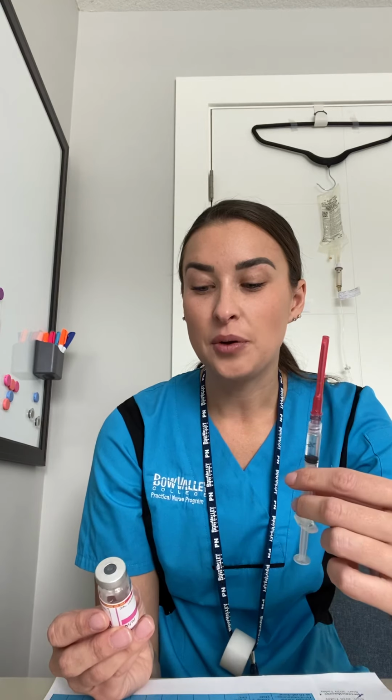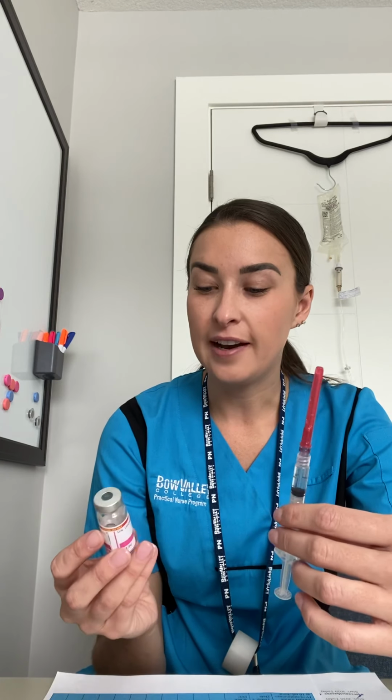We're giving it through IV piggyback. It's okay to do IV or IM. We're going to do it at 1500 on October 26, 2020. The expiry date on the actual medication is October 2030, which will now change. And we're going to give this to Allison for her nausea and vomiting symptoms from her chemotherapy.